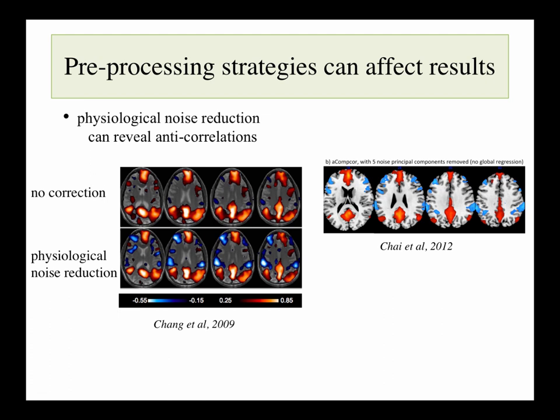I mean, in any given scan, it could reflect a totally different balance of effects. So in one scan, it may be dominated by physiological noise. In another scan, you may just be getting more contributions from brain networks that are more highly active during that time. But this is all still really controversial, and there are a lot of different viewpoints.